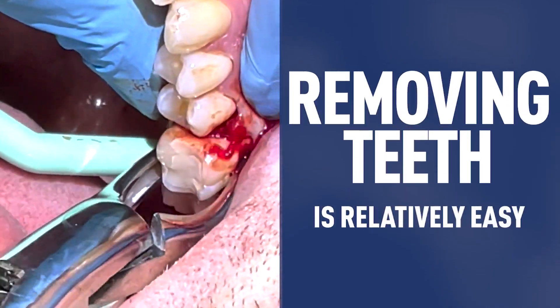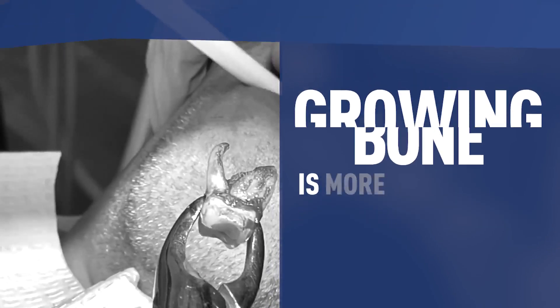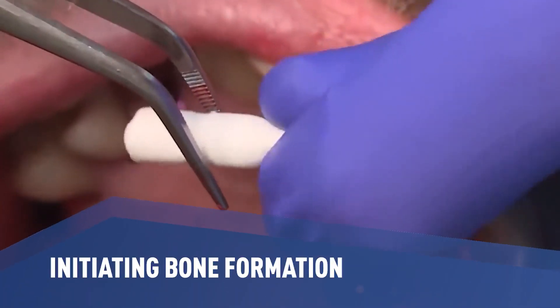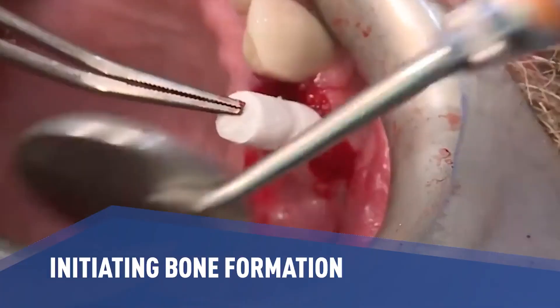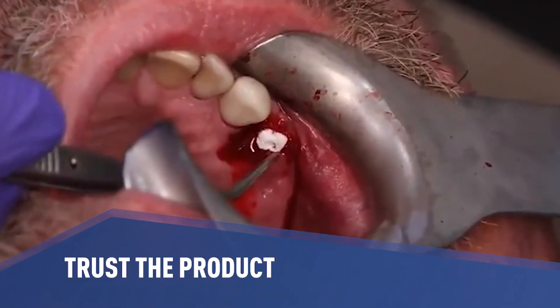Removing teeth is relatively easy; growing bone successfully can be more challenging. So when it comes to initiating early bone formation and angiogenesis when socket grafting, it's important to trust the process and to trust the product.